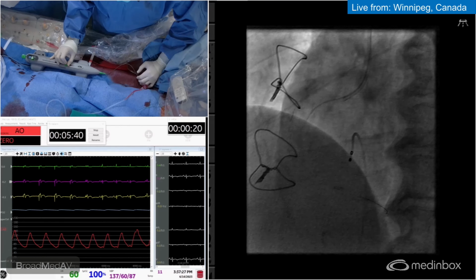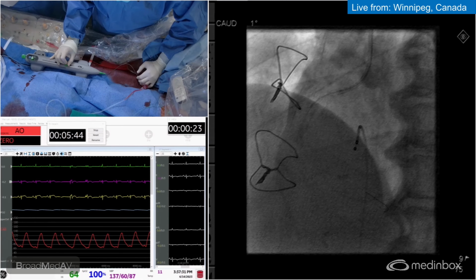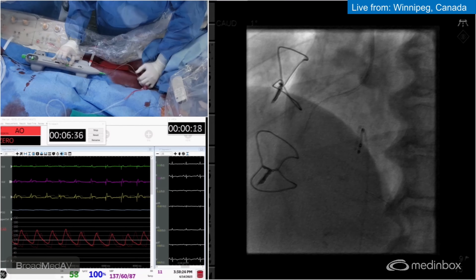Okay, so jump forward there a bit. Give it a pause there. So glad we put in the pacer wire because we're doing a lot of ablation and it's becoming pretty pacer dependent.